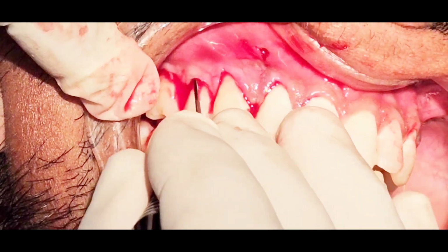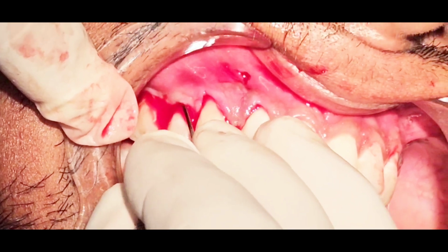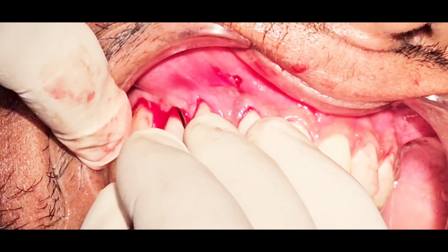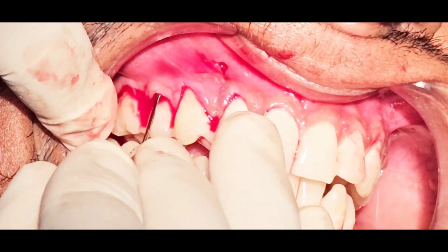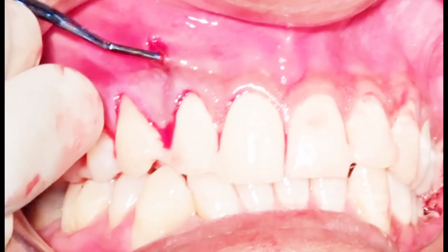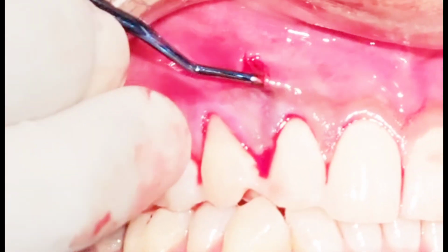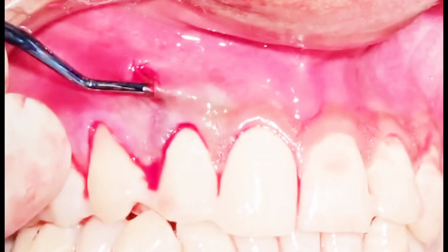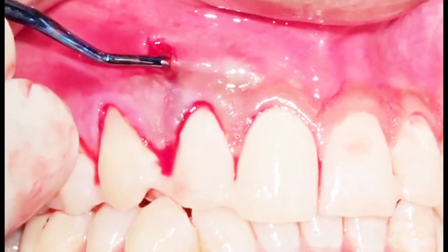Also at the second premolar area, tunneling is done beyond the distal line angle of the second premolar, almost reaching up to the mid surface of the first molar. Also on the other side, that is beyond the lateral incisor, reaching up to the mid level of the central incisor, tunneling is done.